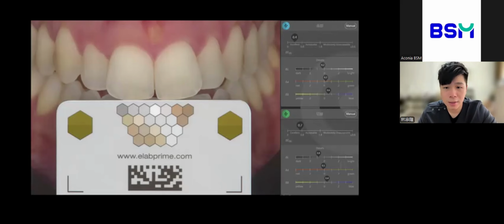What dentists and technicians care about even more is the strength. We all want materials that are stable, not easy to chip or fracture when used as restorations. Success in the end depends a lot on the technician's clinical experience and personal skills. That's why assessed results are always a bit subjective.